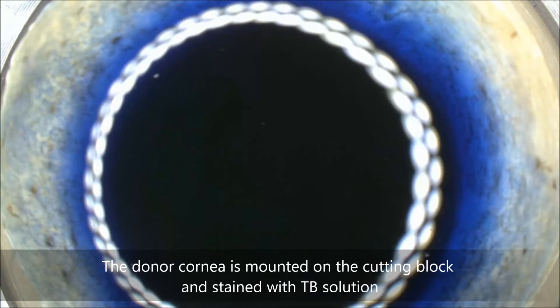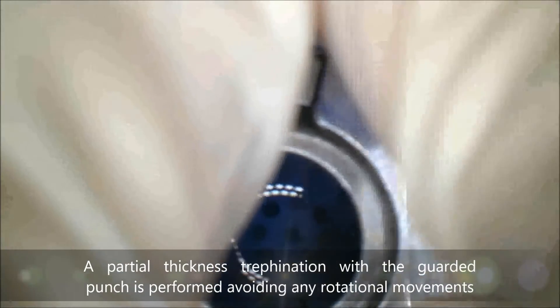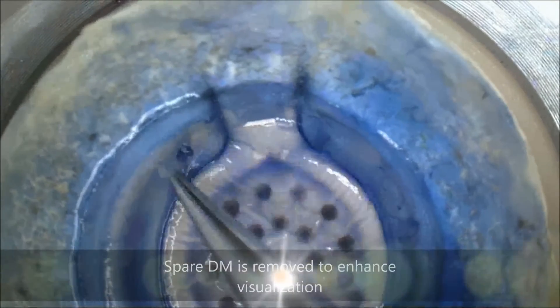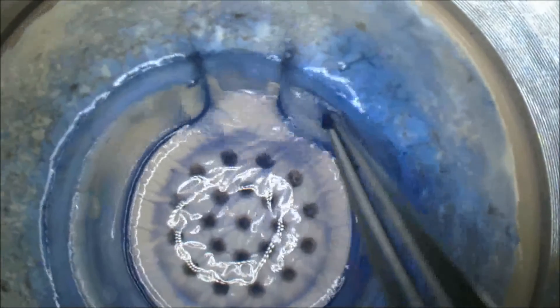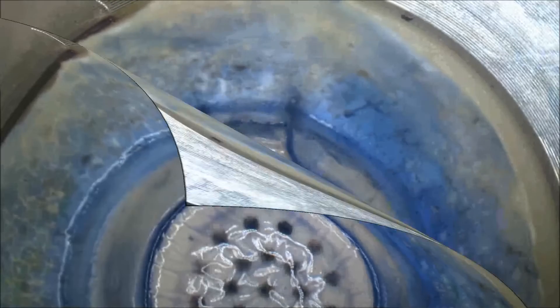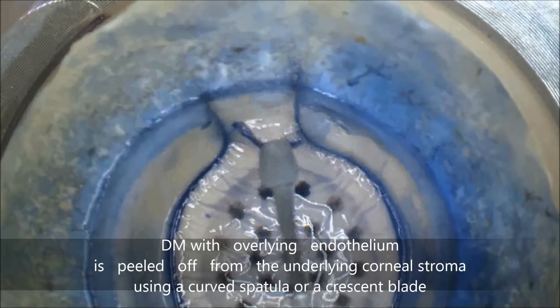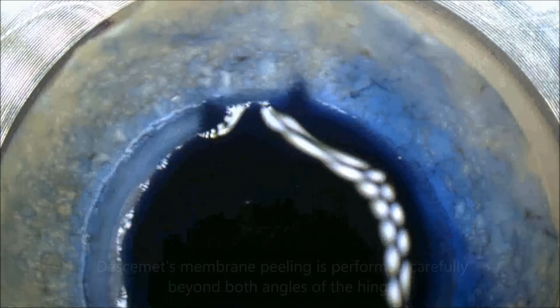The donor cornea is mounted on the cutting block and stained with trypan blue. Then a partial thickness trephination with the guarded punch is performed, avoiding any rotational movements. A non-sharp pointed instrument is used to identify the end of the DMEK membrane at the level of Schwalbe's line in the uncut hinge area, and the DMEK membrane is peeled off from the underlying stroma using a curved spatula or a crescent blade, carefully beyond both angles of the hinge to avoid any radial tears.